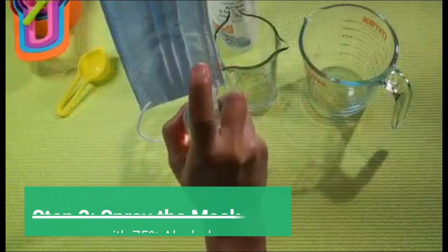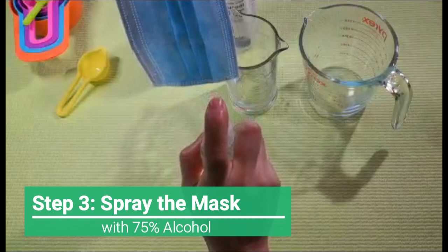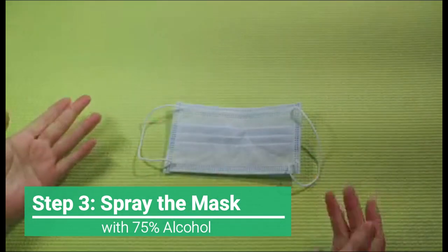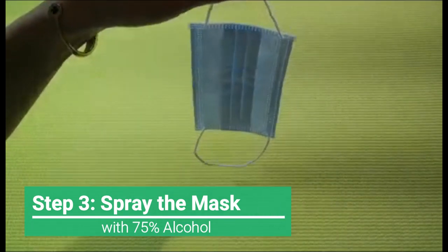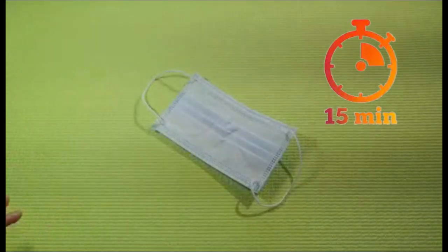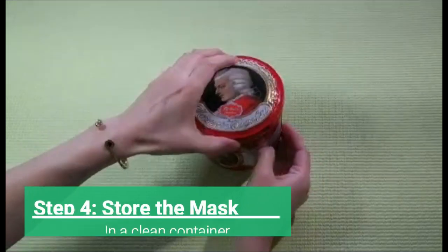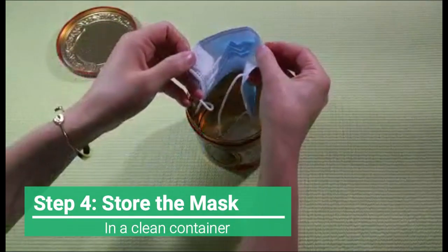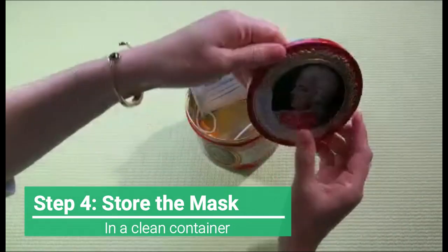Spray the 75% alcohol solution on the surface of both sides. Then leave the mask either on a clean surface or hang it up to allow it to dry for 15 minutes. The final step is to store the sanitized mask in a clean container, and voila, it's ready for the next use.